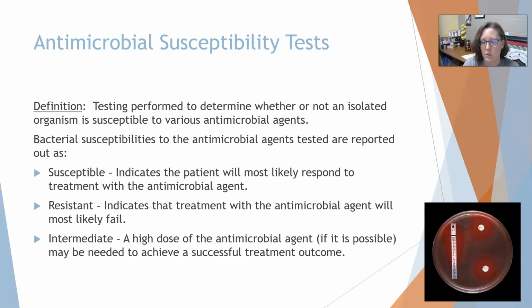So the physician is going to treat the infection based on presumptive information, like signs and symptoms and where the infection is located, and maybe the gram stain results, which can be done on the front end and resulted out really quickly. So they'll start them on something, but you really don't know for sure until you get that ID and susceptibility test whether or not that treatment has actually been appropriate for that patient.